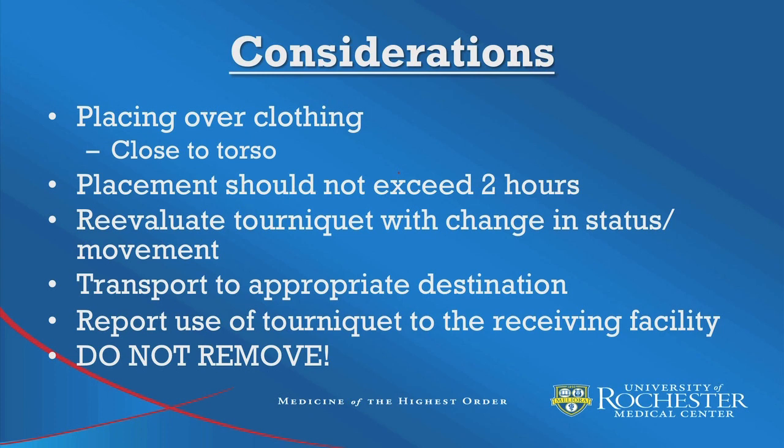If application is going to exceed 2 hours, medical control should be contacted. 3. With any change in the status of the patient or with movement of the patient, the EMT should reevaluate the tourniquet. Make sure the windlass is well secured and bleeding has not restarted. 4. Patient receiving a tourniquet should be transported to the appropriate destination following regional trauma protocols. 5. The tourniquet application should be reported to the receiving facility. And lastly, once the tourniquet is placed on the patient, it should not be removed in the field.